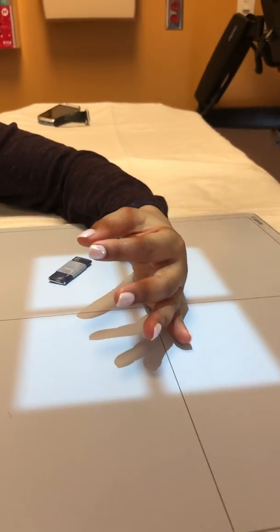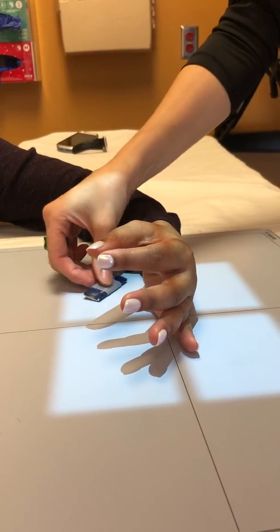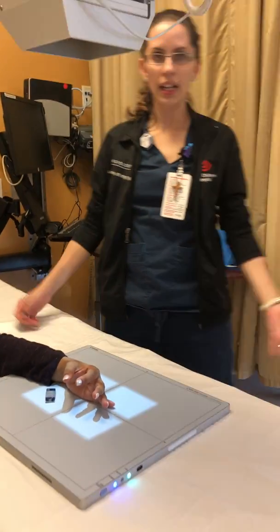And that would be your lateral hand x-ray. Easy peasy. And that's how you x-ray a hand.